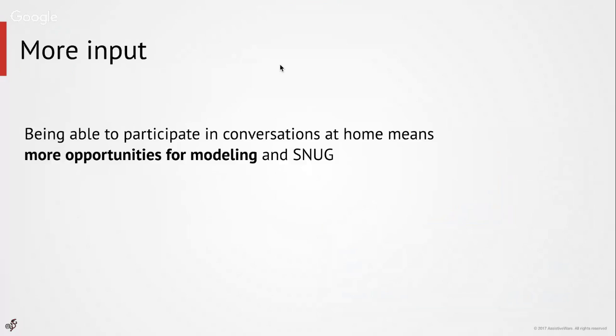So being able to participate in the conversations going on around you with your own words, without the need of prompts, that's going to be more difficult if you can't participate in the conversation in the same language as everybody else. And also being able to use the same language as the rest of the people in your environment increases the amount of language input, as the models you get from the conversations going on around you can be put to use directly without translation. And not only that, it's going to be easier for the people around you to model language for you in your AAC system.